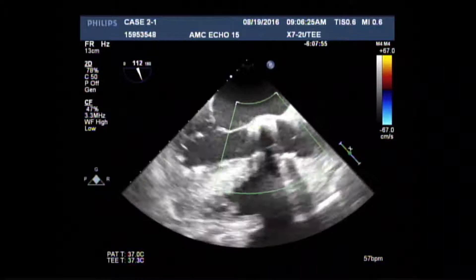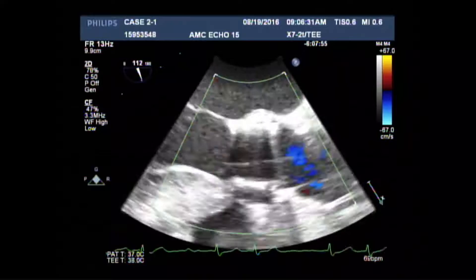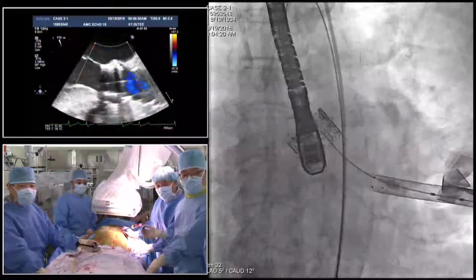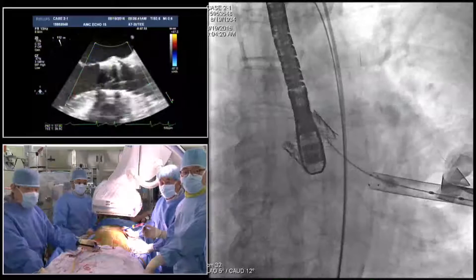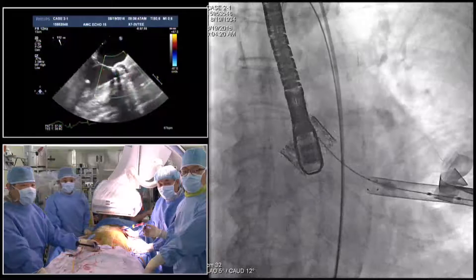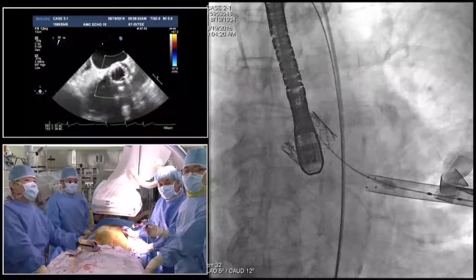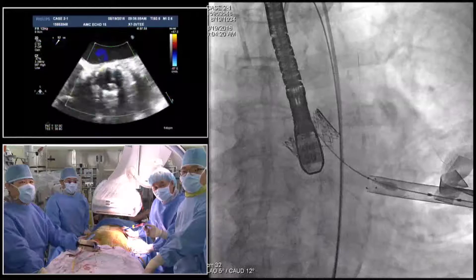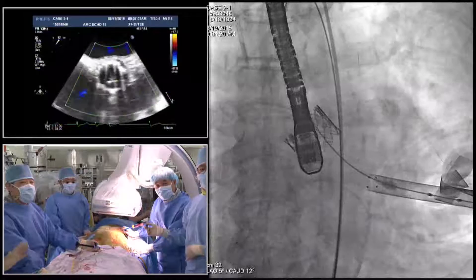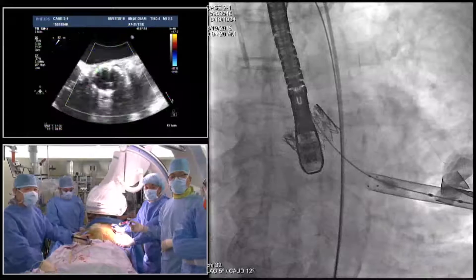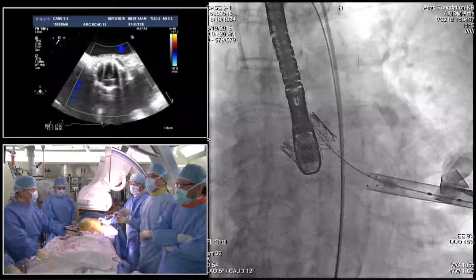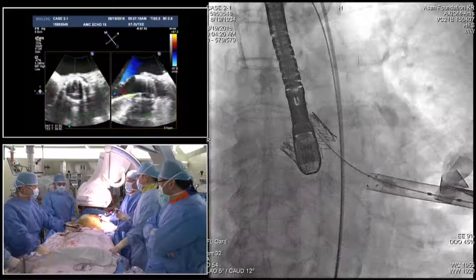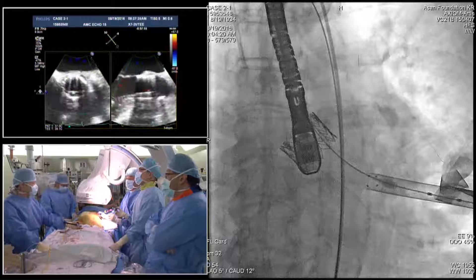The guidewire is still inside the valve so there may be some central leak, but mainly we want to look for paravalvular leak. On TEE you can see the valve position is nicely right at the mitral hinge point. On the long axis I don't see any leak. Going to short axis — there's a tiny bit of leak. In that situation we can either re-balloon or leave it, but I'll do a re-balloon — I want a more perfect result. Before re-ballooning, always do an aortogram to confirm valve position. Don't re-balloon if you don't know the position — that's critical.